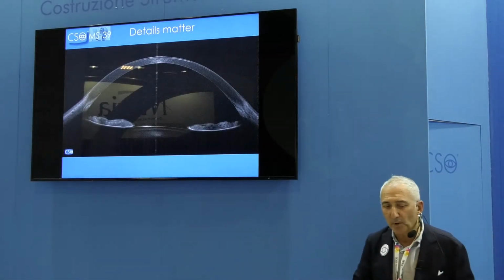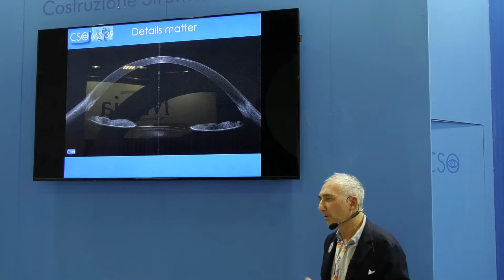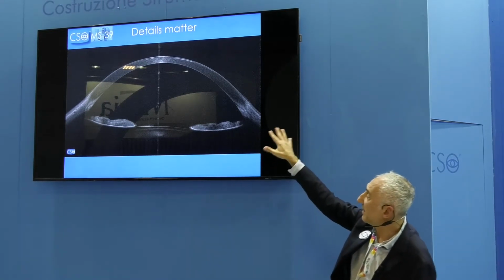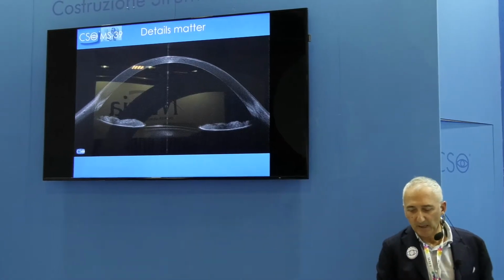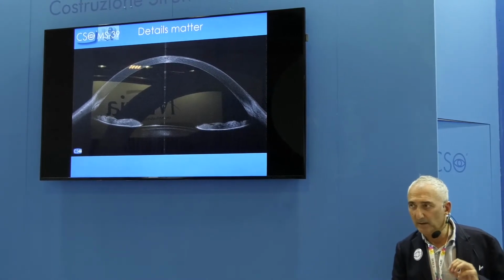It's also very important to me that we can have a precise look at what's going on with the haze after laser treatment. It's a PRK. You can see something is not perfect in the area, and we have a very precise look in the depiction.